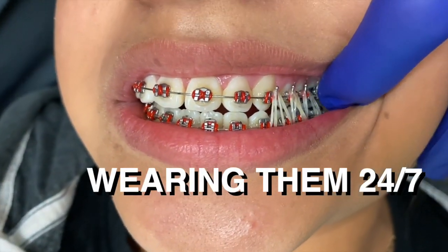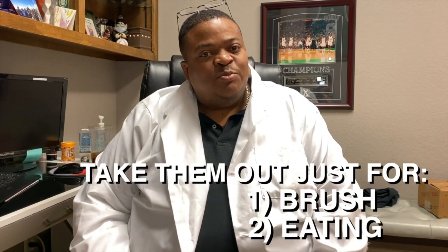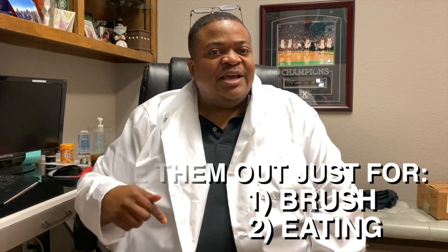When we get to the point where we give you these rubber bands, we need you to be fully on board. You need to wear them 24/7 — you only take them out to eat and to brush, then you take a fresh set and put it right back in. There are lots of different ways we have people wear the rubber bands.